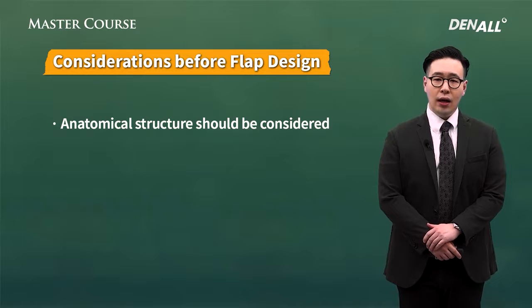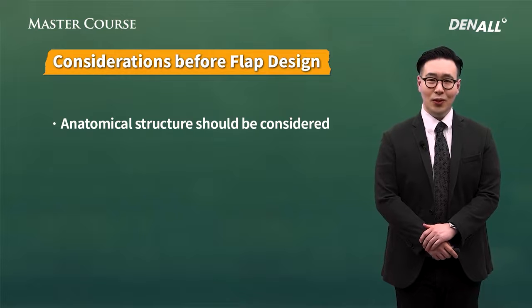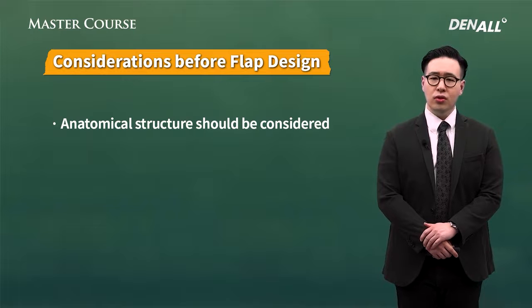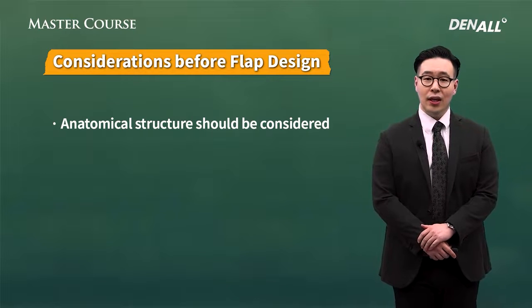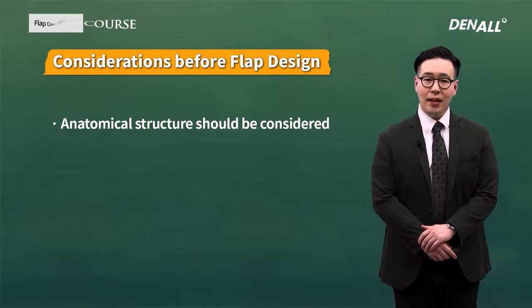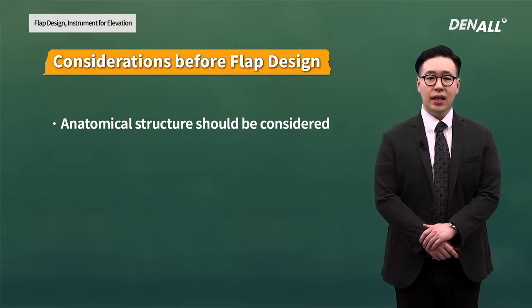If you come across mental foramen and mental nerve, the incision cannot be made and surgery cannot be proceeded. In the lower posterior, incision should not be made too lingually. Lingual nerve is very close with the third molar. In order to prevent this, before surgery, you need to evaluate CBCT.